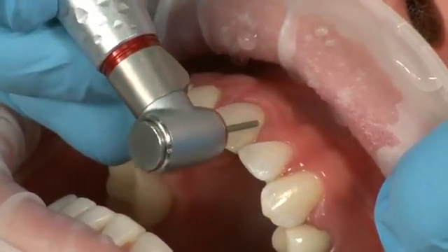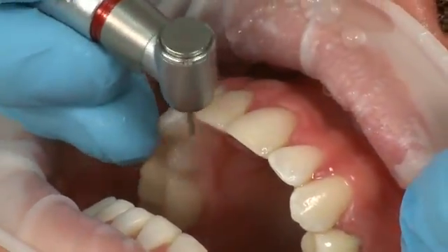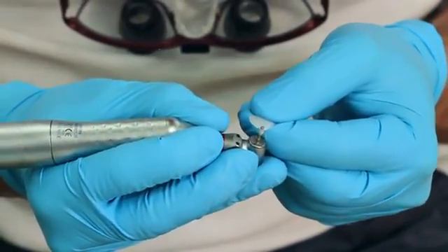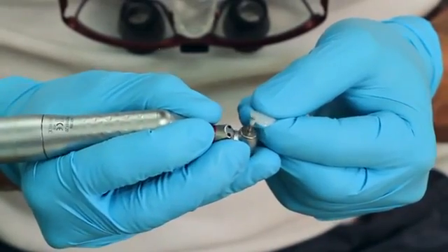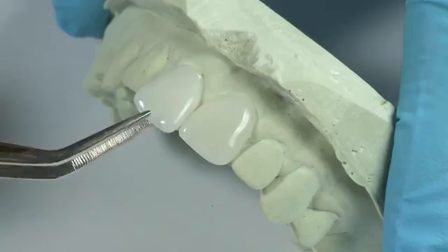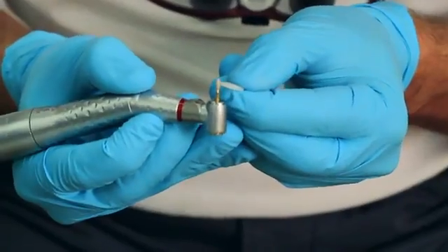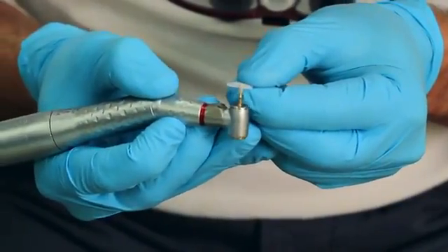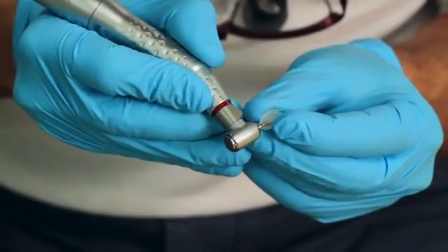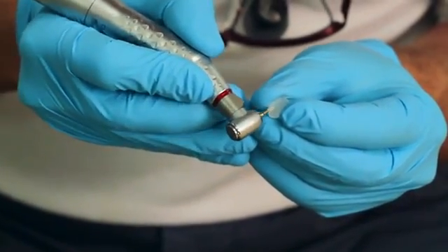Conservatively prepare the tooth, cutting only enough to allow the composite veneer to fit properly. Adapt, shape, and fit the mesial and distal edges and gingival margin of the Edelweiss composite veneer. Pre-appointment adjusting can also be done on a stone model. It is recommended to avoid making adjustments to the incisal edge. Thin the gingival margin after adjusting length to ensure the proper convergence angle to the tooth.